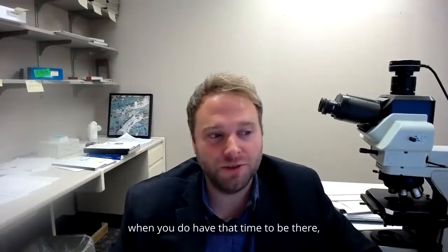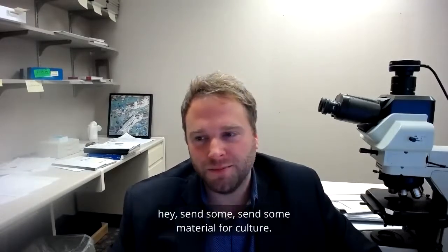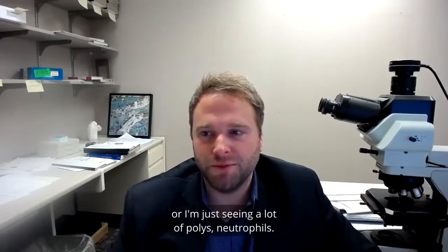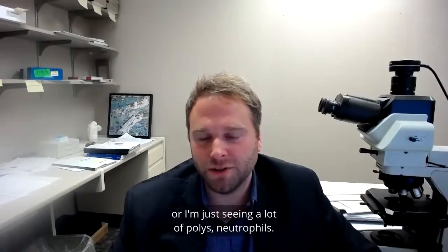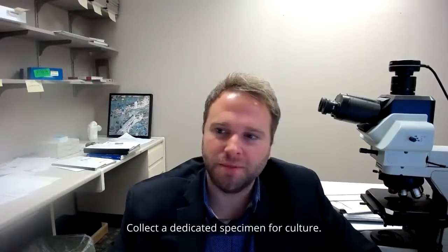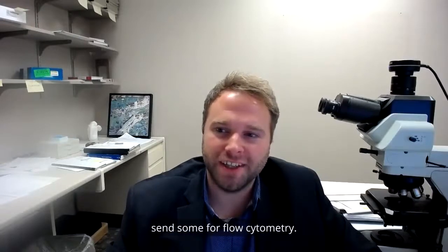But anyways, when you do have that time to be there, you can say, hey, send some material for culture. I'm seeing granulomatous inflammation, or I'm just seeing a lot of polys, neutrophils. Collect a dedicated specimen for culture. If you're seeing a lot of lymphoid tissue, you can say send some for flow cytometry.